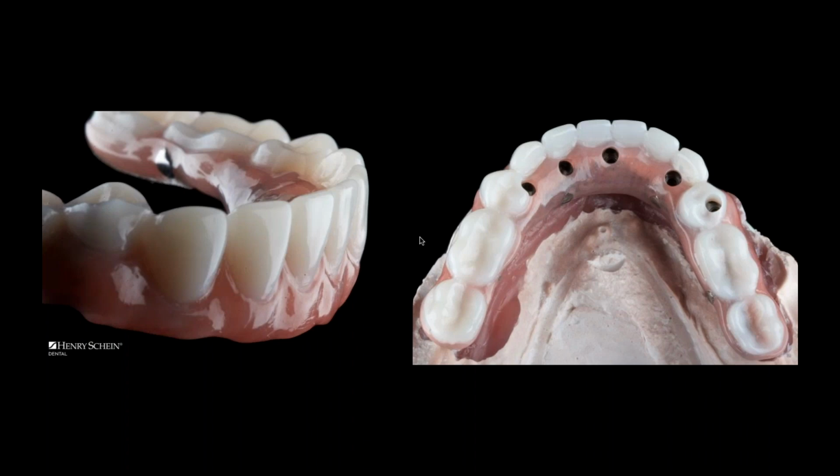I can't do that with a single maxillary central on a natural tooth, because when the patient comes in, I've got to prep the tooth, make the impression, we make the crown, we come back, it's not totally perfect. I want to add a blue hue here, a white spot there, change a contour. It takes me a lot longer to do a single maxillary central incisor, match the shade, match the characterization, than it does to do a full arch of implants today. And that's the power of the technology, and that's where we are today with this wonderful technology.